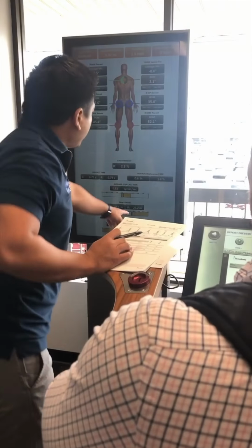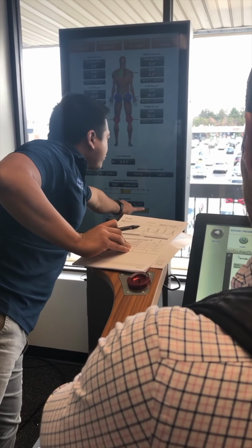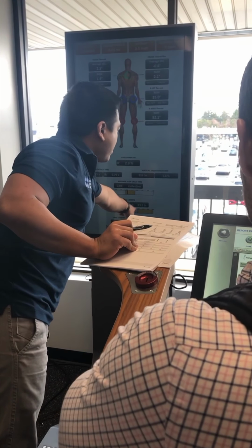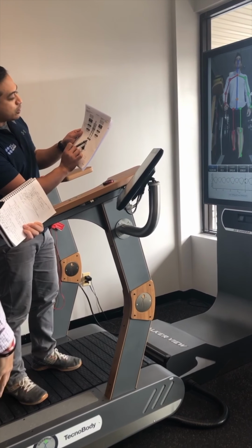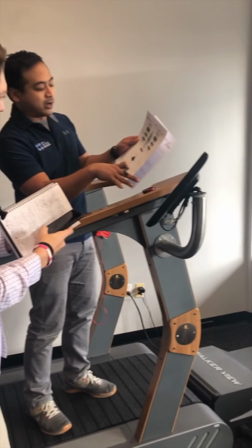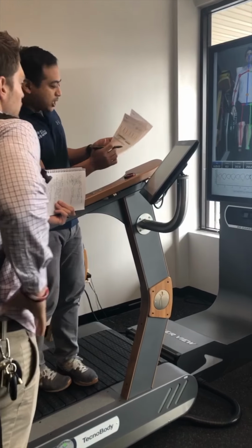But you see how that's yellow and those two lines are your left and right leg and they're in front of the yellow, right? So that means that your step length is short on this side relative to what's normal for your population. Your load symmetry is not bad, but you're walking really slow. So as you walk faster, we would expect this to increase. As you currently sit right now, we would obviously want that to be close to 0.